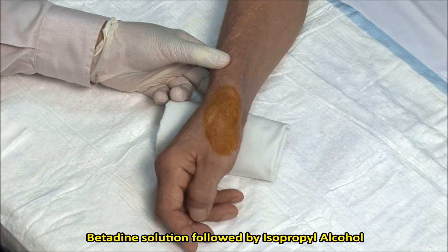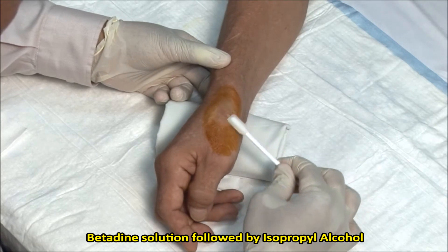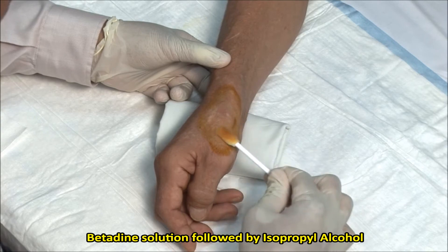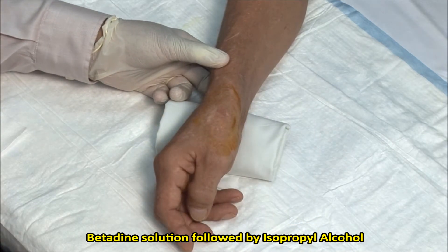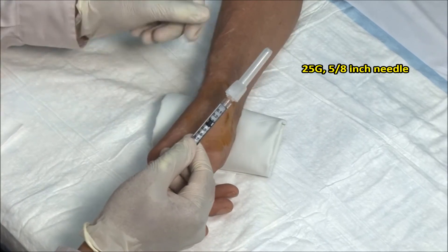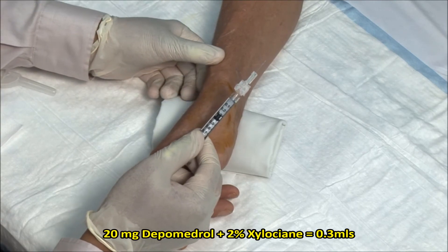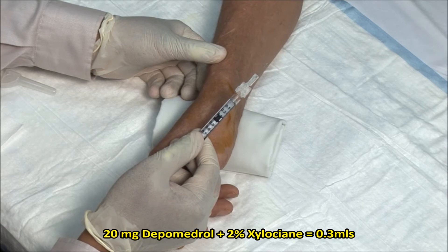Here I am using betadine followed by isopropyl alcohol. I have a 1ml syringe with a 25 gauge 5/8 inch needle and a mixture of 20mg of depomedrol and 2% xylocaine, with a total volume of 0.3ml.